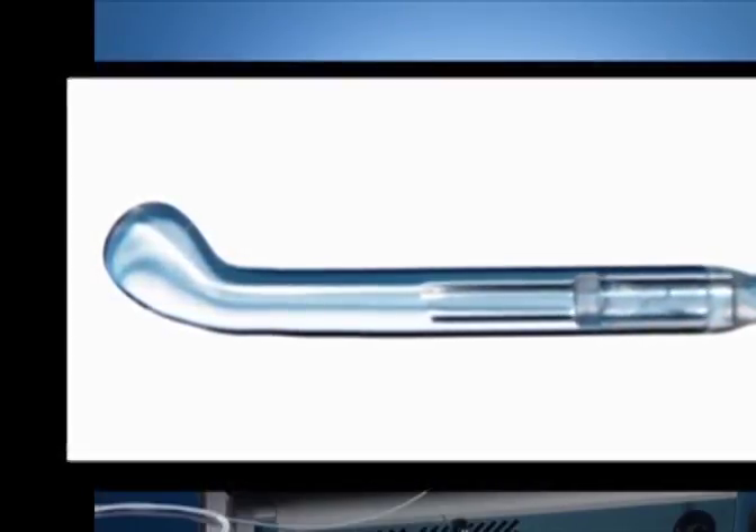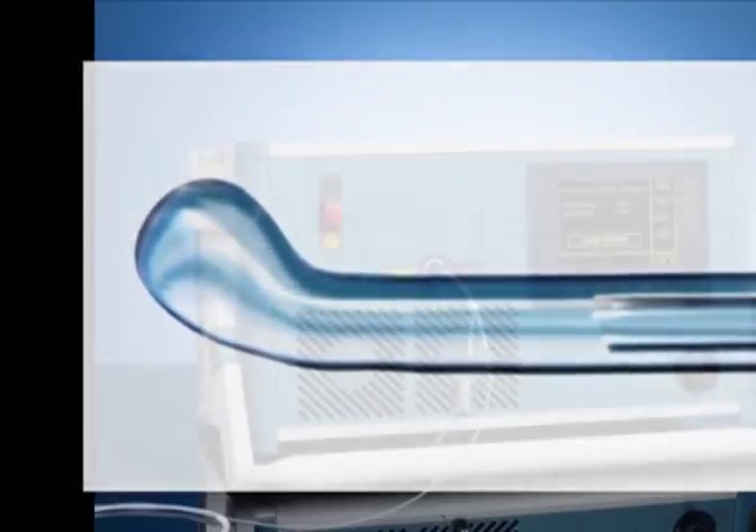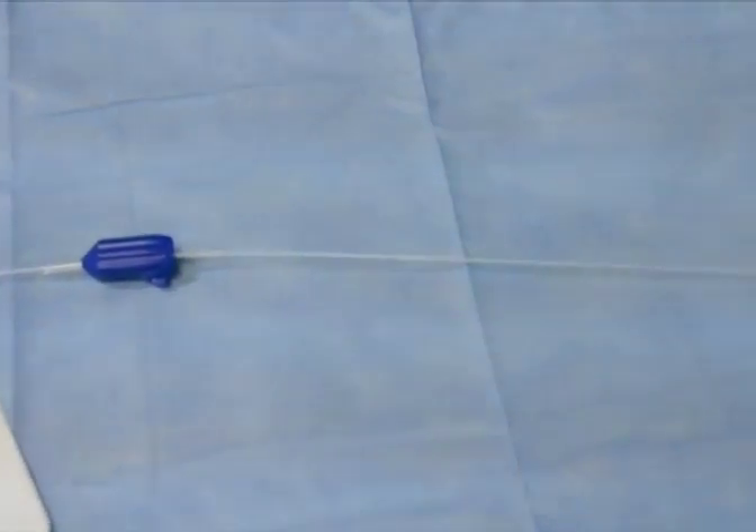This fiber is an end-firing fiber with 30 degrees angulation at its distal end, overlaid with quartz to concentrate the energy at its tip. The fiber works in a contact mode and does not emit a free beam.